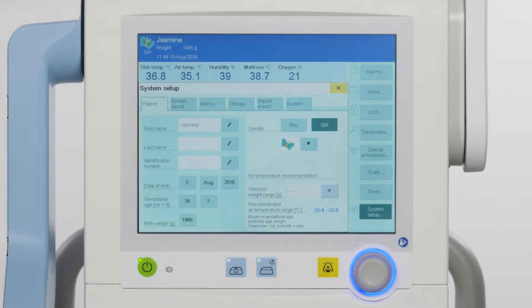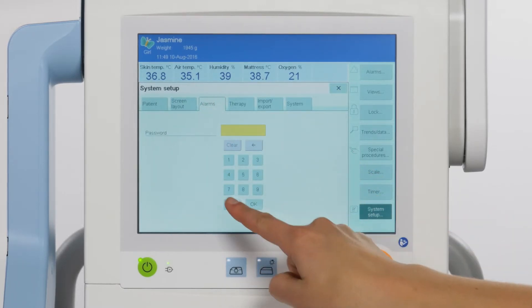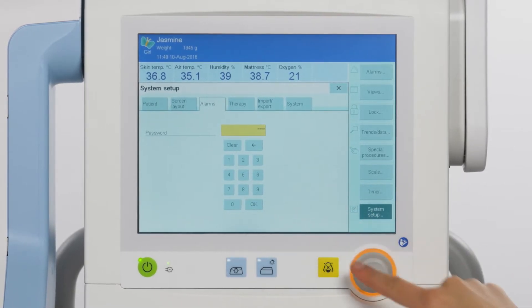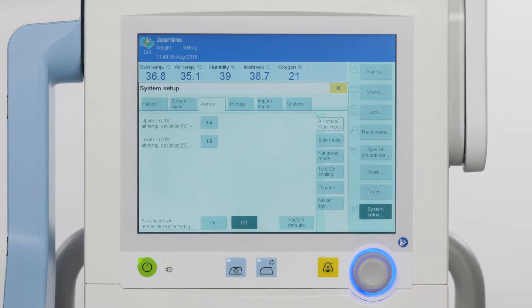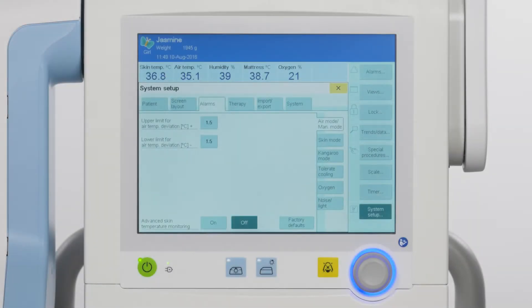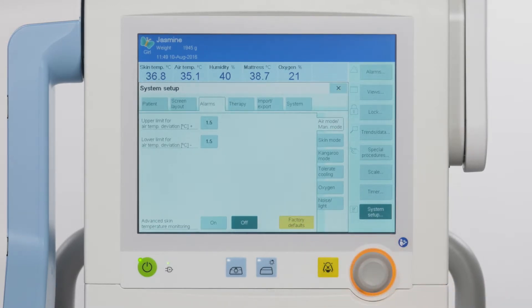In order to modify some entries under system setup, a password needs to be entered — for example, for alarms, therapy, and export-import of the configuration data system. Various settings are possible for the device. Draeger will deliver the device with factory settings, which are used when starting the device for the first time. You do have the option to reset to factory settings when necessary. To do this, open the relevant tab in the system setup, touch the factory default button, and confirm.